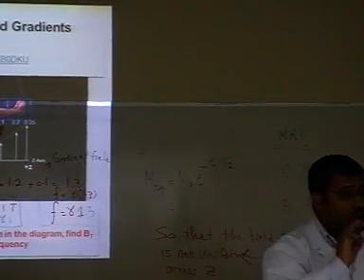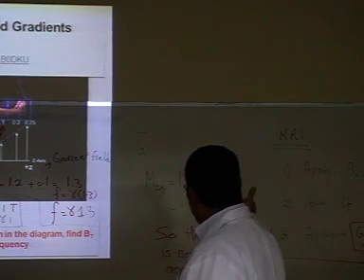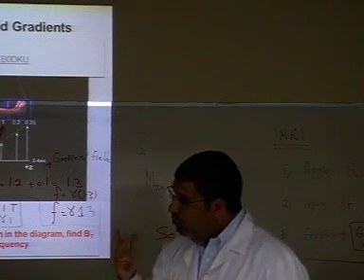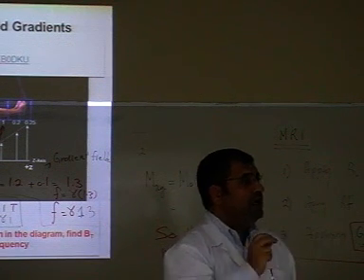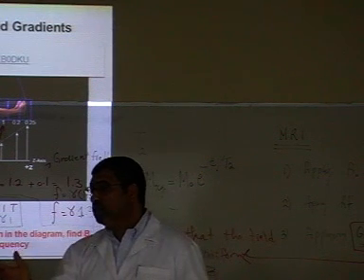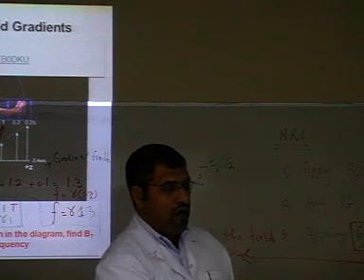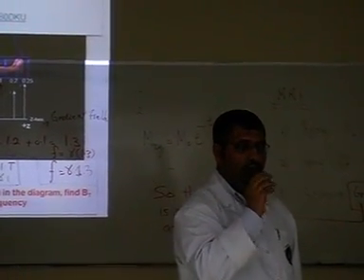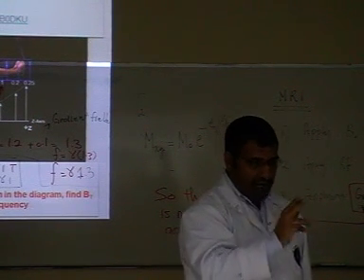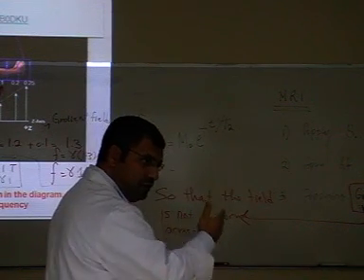Because remember, guys, these are three very important parts of a magnetic resonance. The B0, that's the first thing you do, and then the RF, and the third important part is applying the gradient field, or the addition of a gradient field. Can somebody tell us what's the significance of the gradient field in MRI? Go ahead, louder. So to select, okay, and how do we do that? Let her finish. By adding the gradient field.